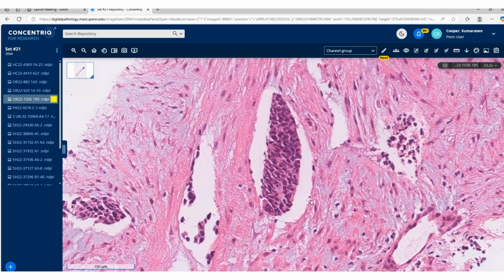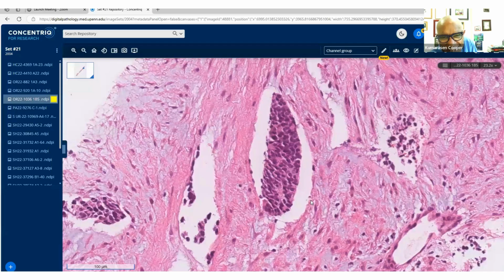Okay, so yeah, I was thinking more in line with angiomyxoma. And so ER, PR, I think, and CD34 too. CD34 is negative. Okay. That's a good start. It's a good start.